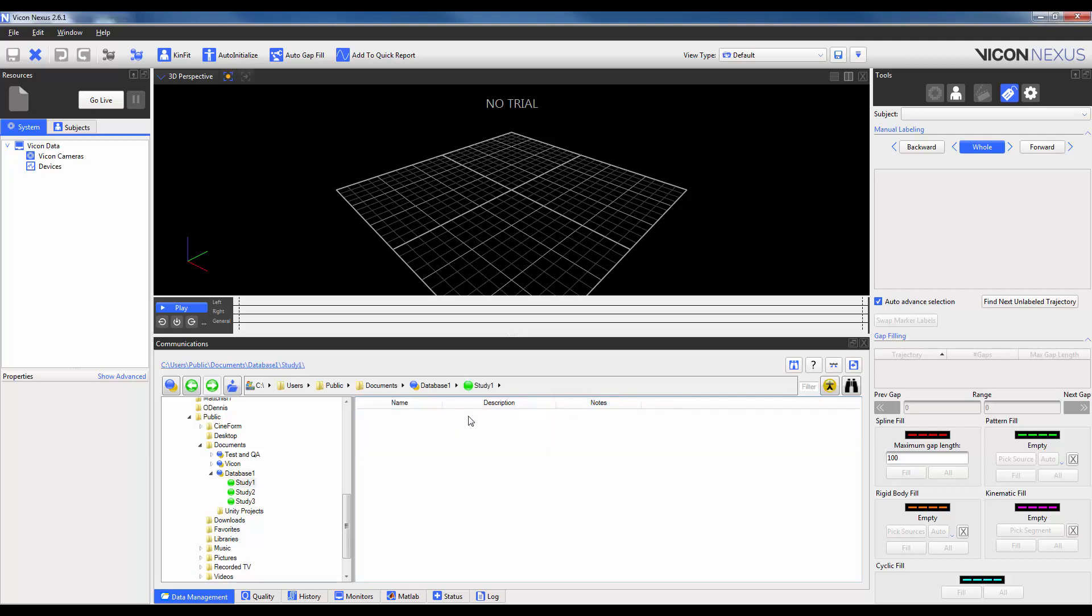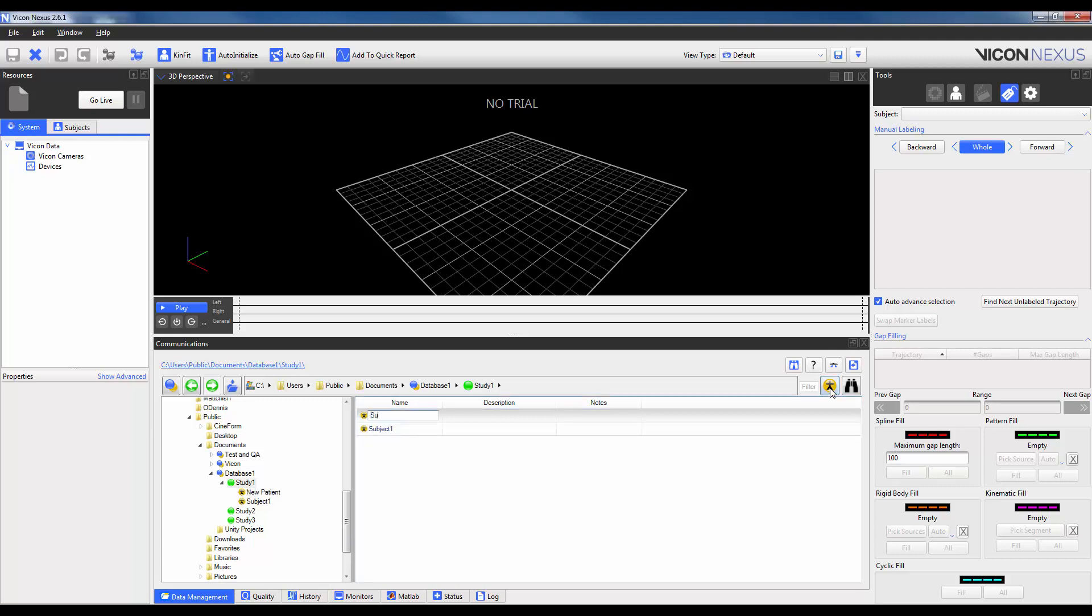Within a study, I'm going to have multiple subjects or participants that comprise my study. So, subject 1, subject 2, etc.